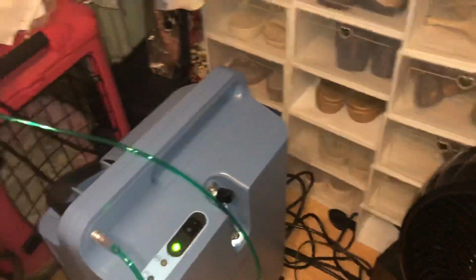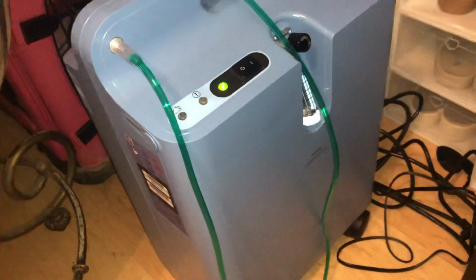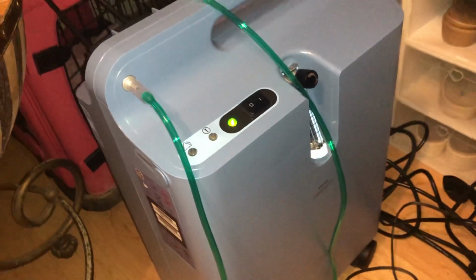So then we've got these little ports. It's kind of hard to see, but there's two black things. Well, the middle one's a nebulizer. That one is for the humidifier, and then the other one over here is where the oxygen comes in. I can feel it coming in. The oxygen tank works non-stop. You don't have to refill the oxygen. It just works out of the air in the room.